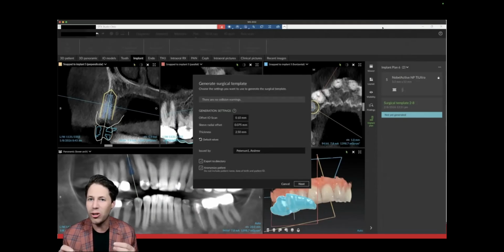I've actually gotten calls from my referrals asking me why I did the final crown. And I said, whoa, whoa, whoa. This is only temporary. My referrals and my referral network love the technology. We love how it's serving our patients better. So I hope you've learned a little bit about what the implant planning process looks like here at Arcadia Perio.